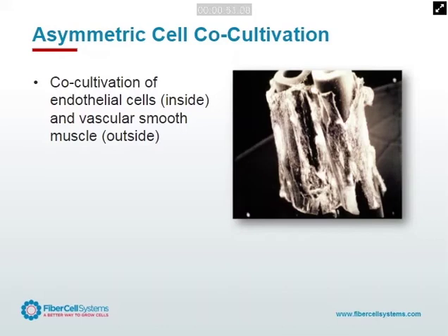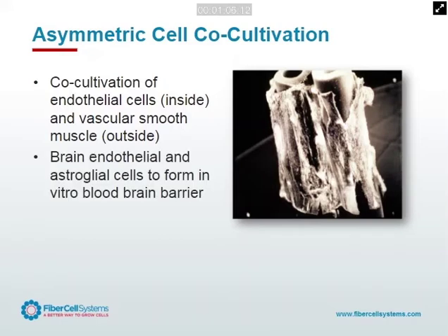And endothelial cells provide very important functions. They control the composition of the interstitial fluid, which cells are actually growing in, which is actually quite different than the composition of serum itself. They're responsible for the blood-brain barrier. They're responsible for cancer metastasis. They're responsible for stem cell homing. So the only way to really get true physiologically relevant endothelial cells is to grow them under shear.